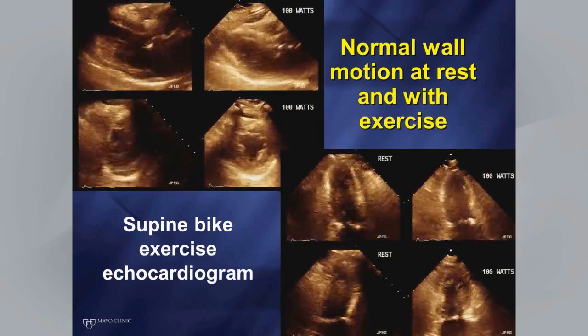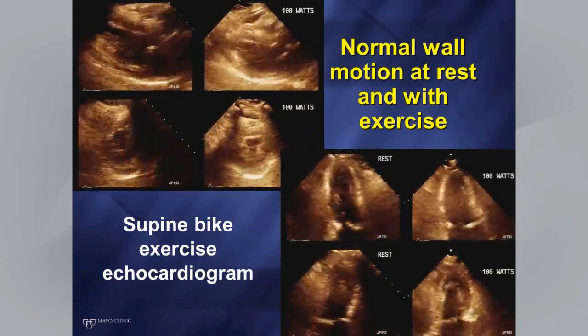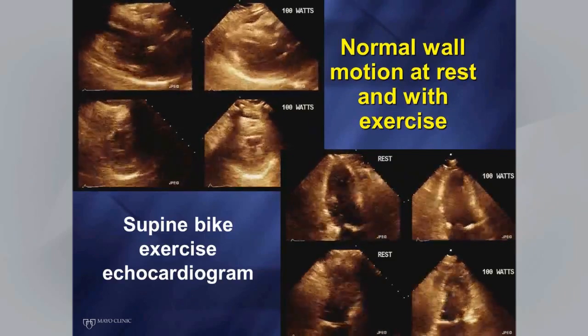She did a supine bike exercise echo, and you can see that her wall motion is completely normal at rest and with exercise.